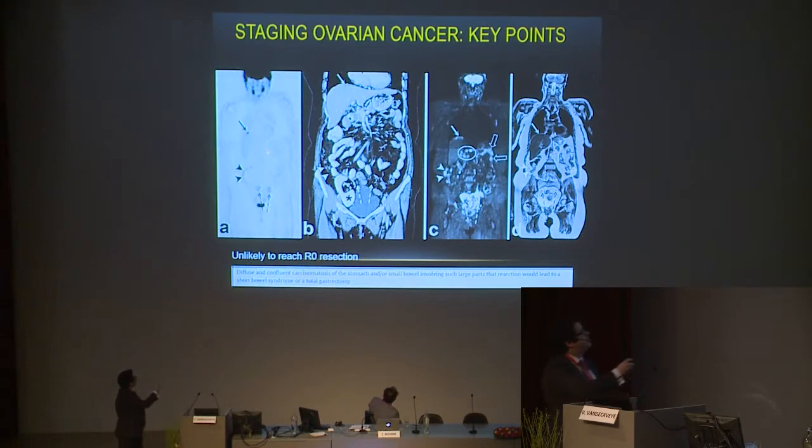This patient received a PET-CT, and that's usually what we get. On the CT, you see a lot of infiltration, but actually you don't know, is it edema, fluid, or tumor? The PET says, not a lot to see, just a little bit here. Yeah, this may be bowel or tumor, the two primary tumors.